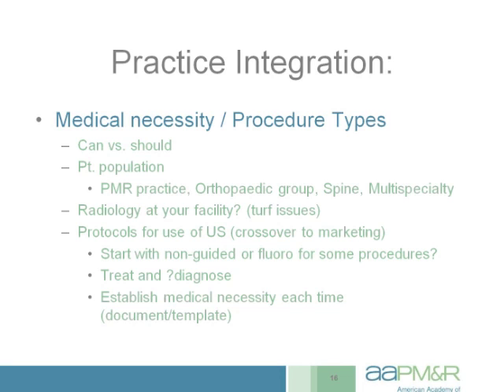They also sometimes will send me procedures that will be purely diagnostic, where they're having trouble narrowing down the pain generator, and they'll send it to me for a series of local anesthetic injections where we might inject the AC joint one week, the subdeltoid subacromial bursa the next week, and perhaps the glenohumeral joint after that if we don't yet have an answer. You also have the option of whether or not you're going to be doing a diagnostic ultrasound in your practice in addition to injections.